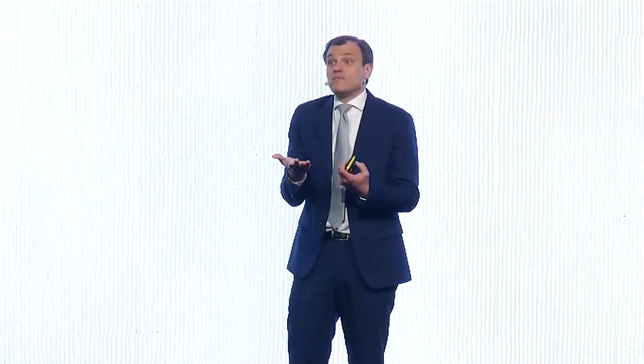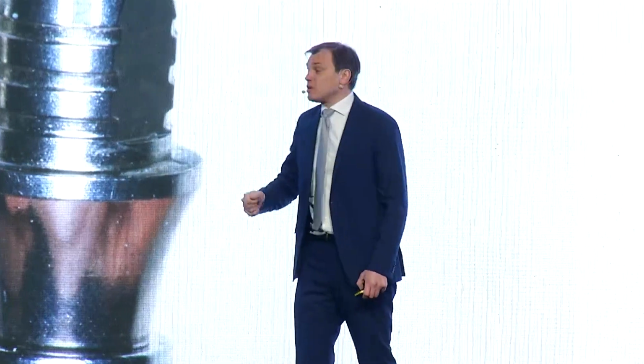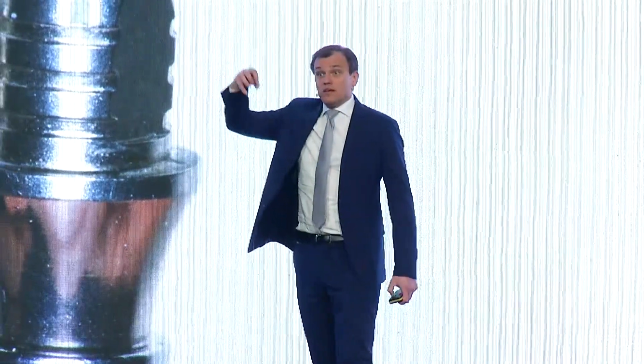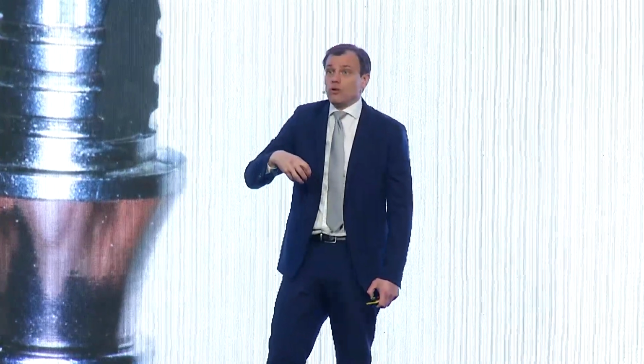So first of all, as I said, look at it from the implant position point of view, where the implant is placed. And what I really liked, because I watched all the previous presentations, is that the bone profiler is a magical tool.